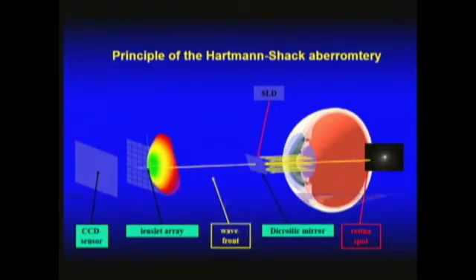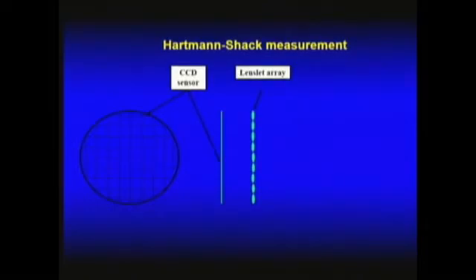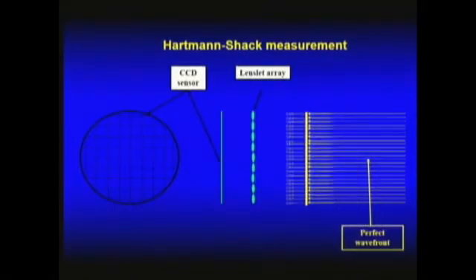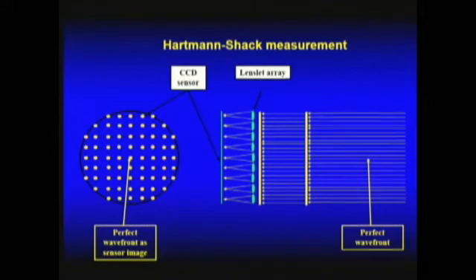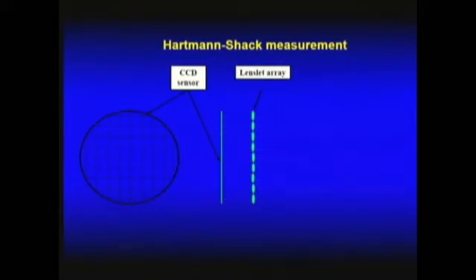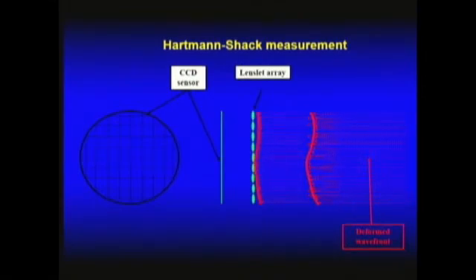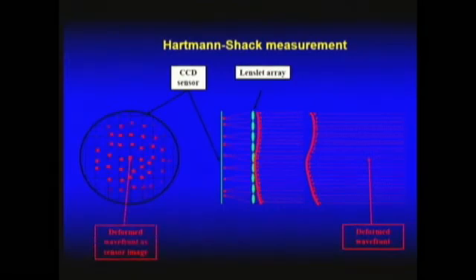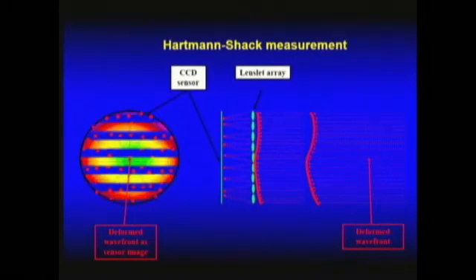as a wavefront of parallel rays, and if the whole optical system is normal, we will get a flat, very regular wavefront. It's a perfect wavefront in the photosensors. But if we have any alteration in, let's say, the cornea, the lens, or the other clear structures of the eye, including the tear film, we will get an abnormal wavefront.